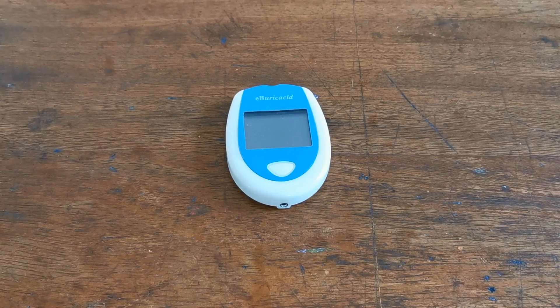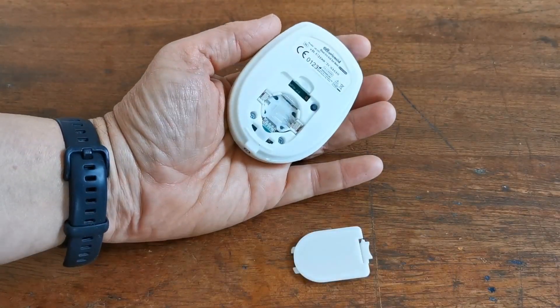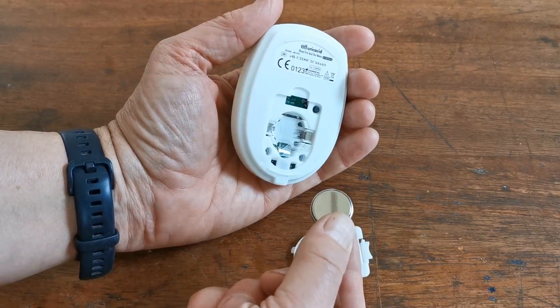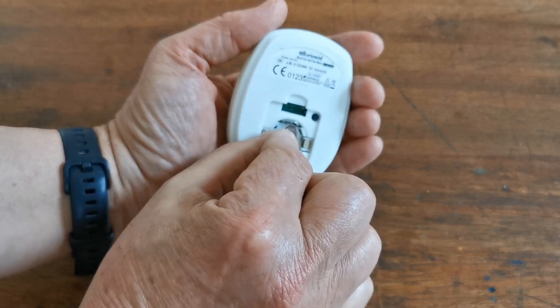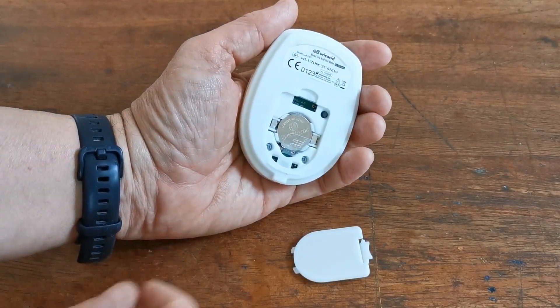Let's now show you how to set the year, time, date, month, and day on the EB-Uric Acid meter. Flip it over and open the battery port and pop the CR2032 cell battery in. It goes upper side down so the flat side is pointing upwards — just push it down into the battery port. You'll hear it beep.